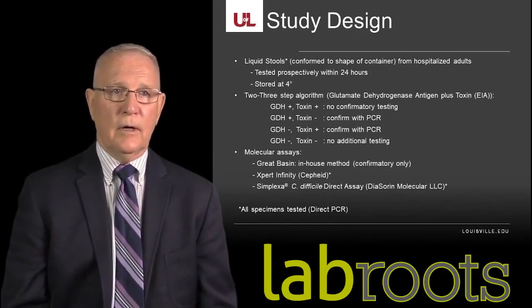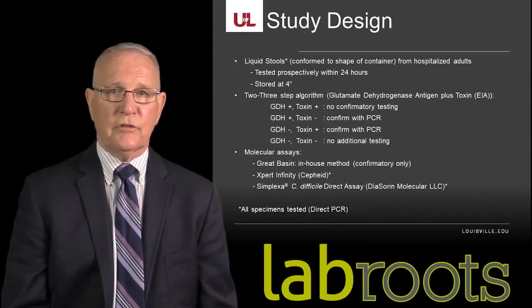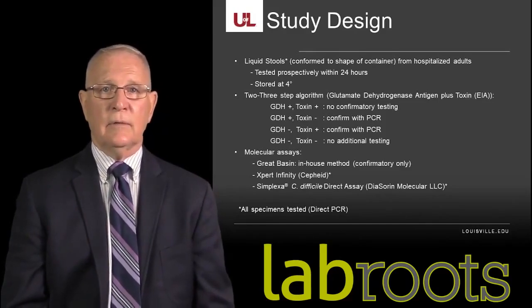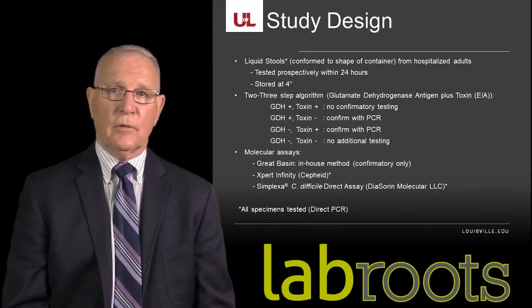So in our evaluation, 3 molecular assays were involved. The first, as you can see, Great Basin, was the technology that we had been using in our laboratory for 4 or 5 years. And so it's our in-house method, and it was used for confirmatory testing only.